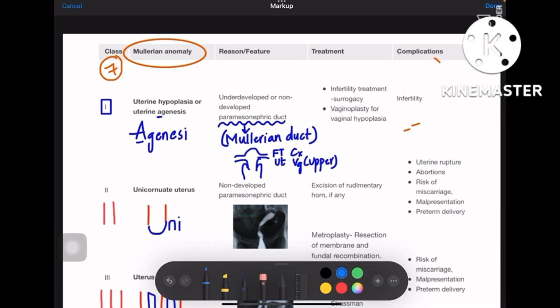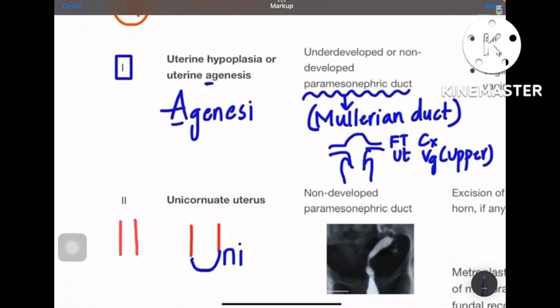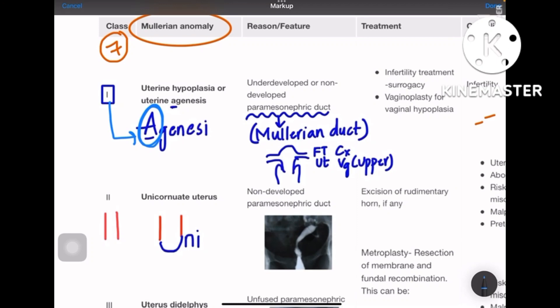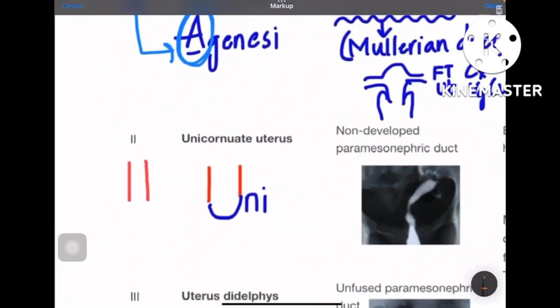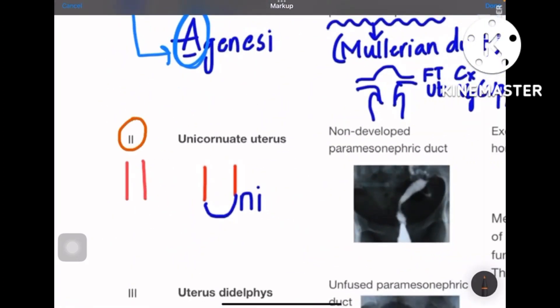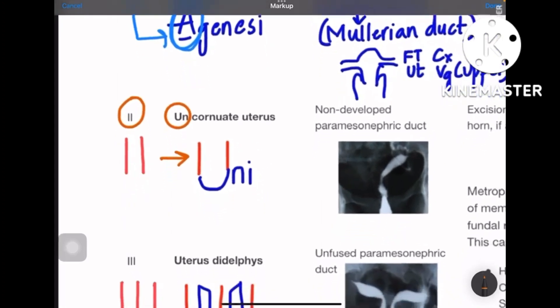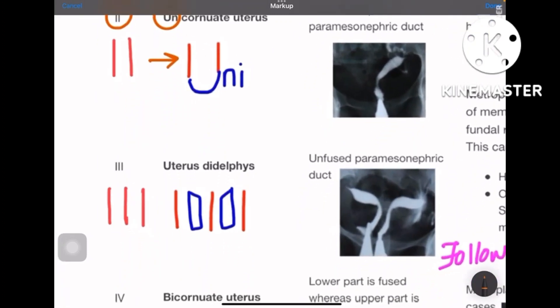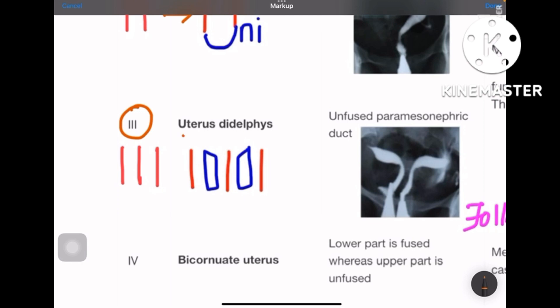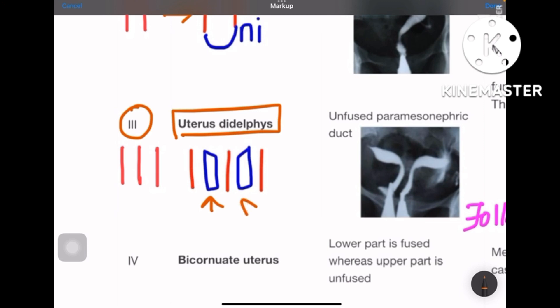Class 1 is for agenesis — Müllerian anomaly class one is uterine agenesis or uterine hypoplasia. Class 2 is for unicornuate uterus — 'two' reminds you of 'uni.' Class 3 is uterine didelphys — in Roman numeral three you see two different compartments, so two compartments of the uterus fit into class three.